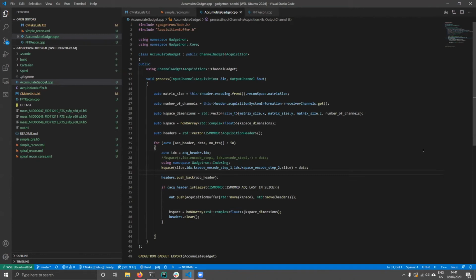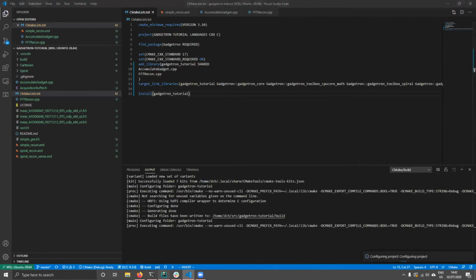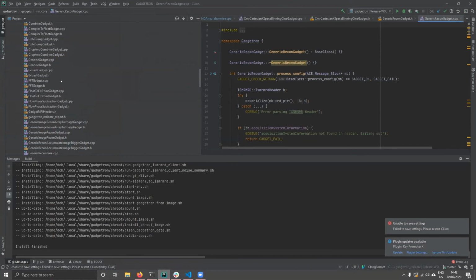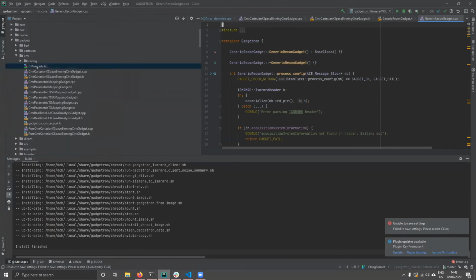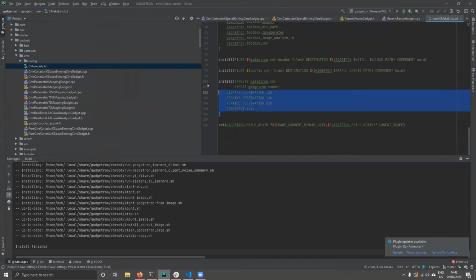We have a question from Sue, how to add the custom-built gadgets, the library files, into the Gadgetron compiled library. I think that's within your CMake lists. Yes. So what I'm doing right now is I'm not actually installing anything. I would need to add something like this. Hang on. I don't actually remember this. I'm just gonna go and cheat and have a look at how we're doing it inside Gadgetron. Yes, this is cheating, but I don't remember CMake that well. It is mostly copy paste. There we go.